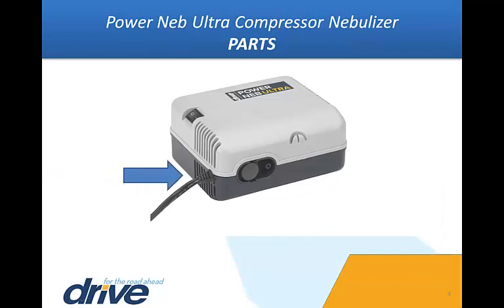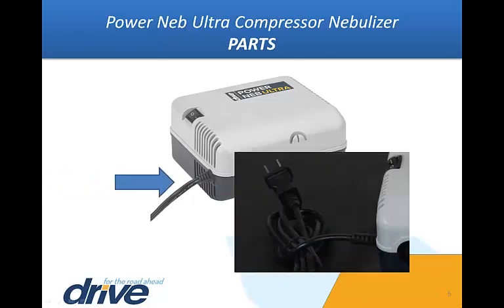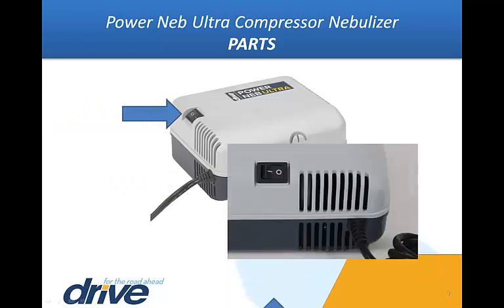Parts. This is the filter cap. This is the air outlet connector. This is the power cord. This is the power switch. The O indicates the off position. The I or dash indicates the on position.